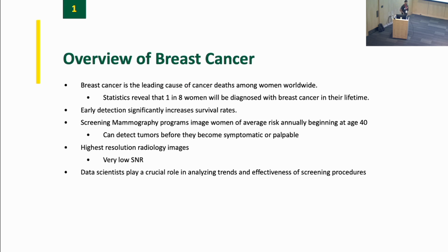They are unique in radiology imaging in that they are among, if not the, at least the highest resolution that I can think of. It's the highest resolution 2D image in radiology. So these images are typically on the order of 8 megapixels or so. So you'll have something that's around 3000 by 2000 or 3500 by 2500 pixels. And then the other challenge is that the signal to noise ratio in these is amongst the lowest of everything in medical imaging. So I'll show some examples on this at the symposium on Friday.